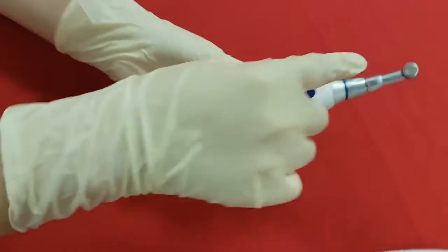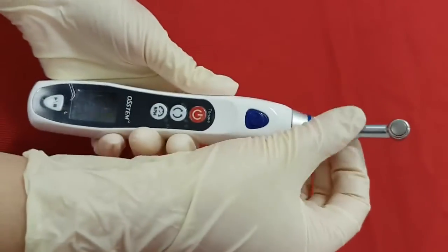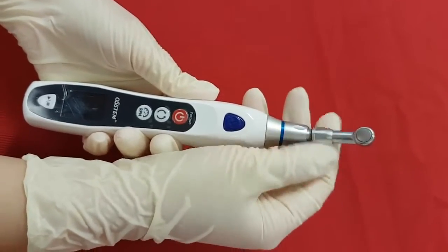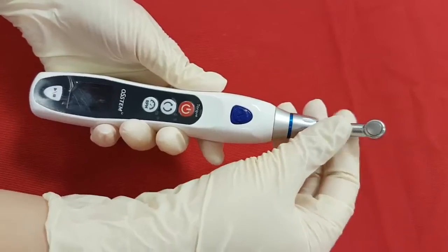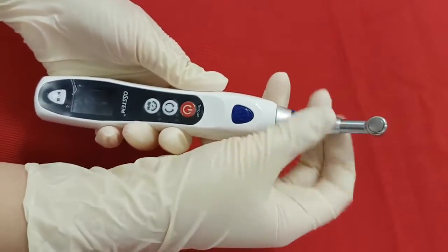On the top there is a contra angle head, which is easily separated by opening the neck part counterclockwise for disinfection. You can use the autoclave for 15 minutes, but only for this head part.